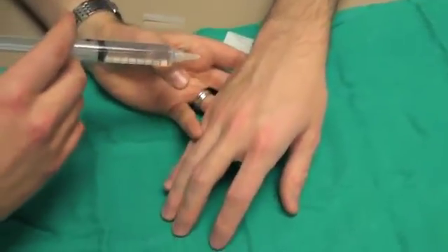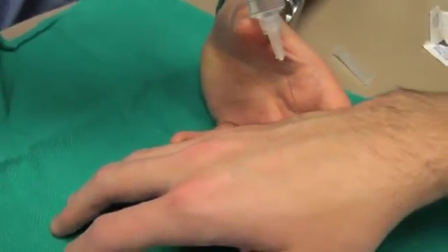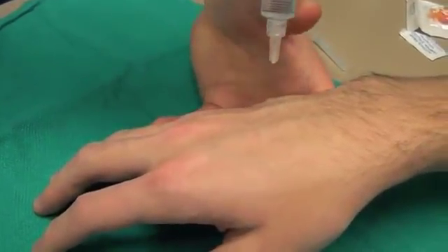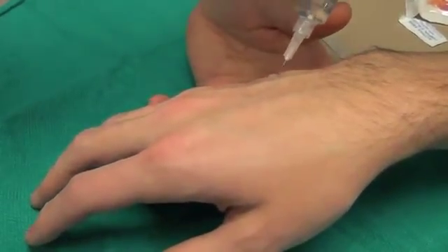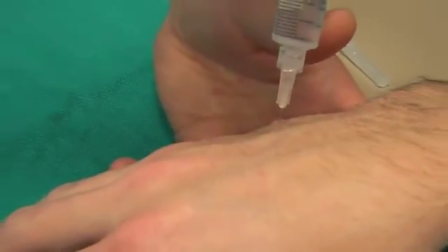Then passing on either side of the metacarpal, perpendicular to the skin, to a sufficient depth, and then injecting approximately two to up to three cc's.